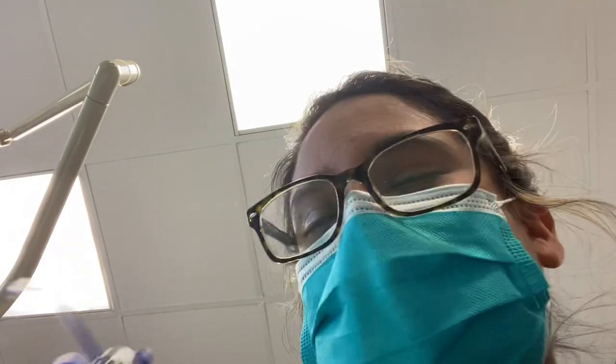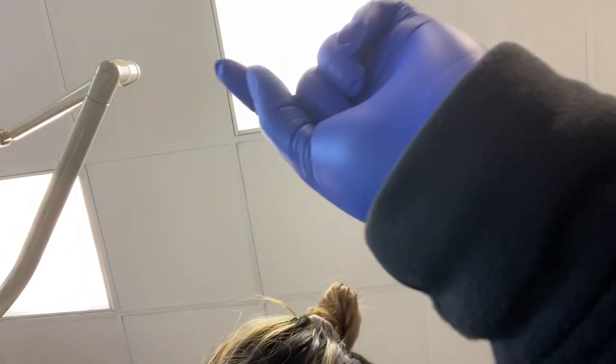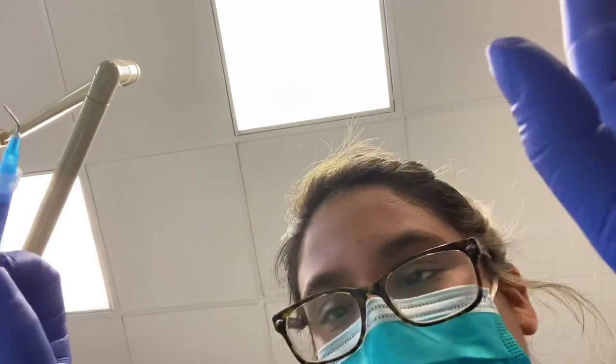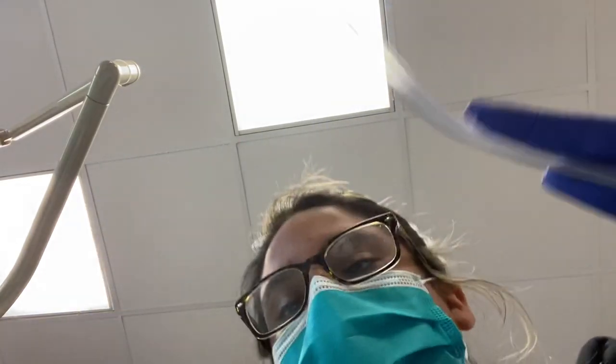Awesome. And then I'm just going to put a little air on your tooth. So we're just going to do a white filling. This is not a needle — it looks like one, but it just comes right out of the tube. See? No needle. And it's only going into your tooth, just like this. A little. That's it. That was okay, right? Good. Just let that kind of set for a little bit.